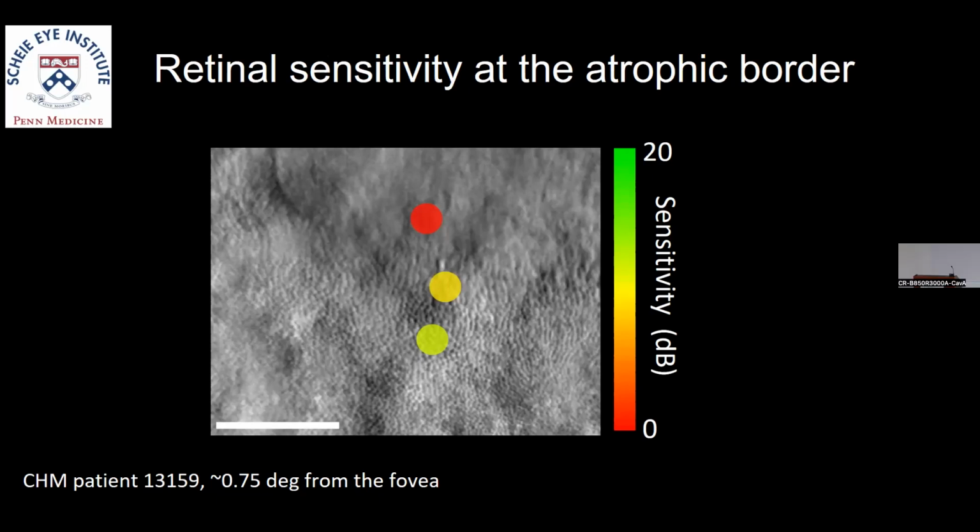Okay, so if you're imaging, you're using what exactly? It's more or less a 795 nanometer beam. It is visible, so I know it's in the near infrared, but people do perceive it as kind of a deep red. So you always have to keep that in mind.